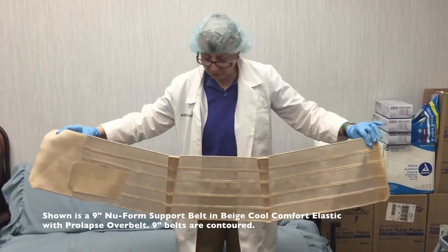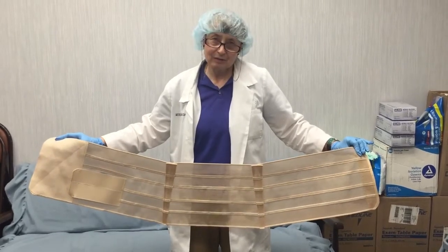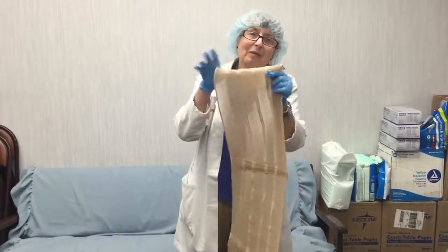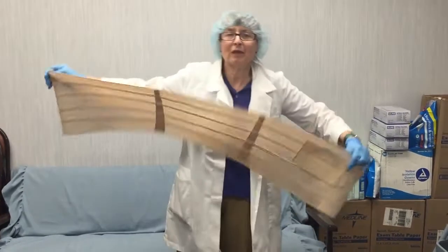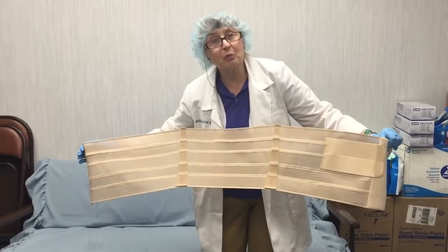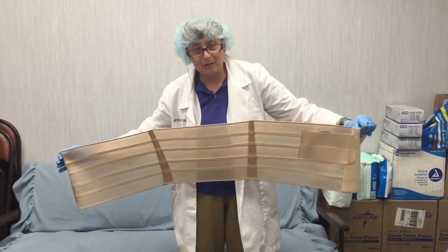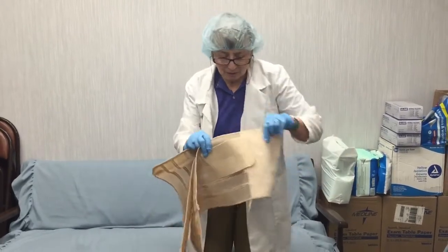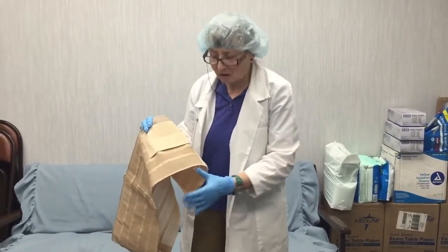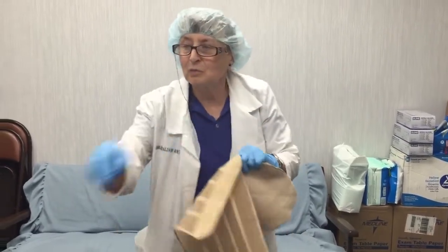Nine-inch belts are typically contoured so that they are wider at the bottom and narrower at the top — most women are a little wider at the bottom and narrower in the waist. However, with a man, it may be better to reverse that so it's wider at the top and narrower at the bottom, which is what I've done for this particular gentleman. When we had the belt on, you could see how it was going to dig and cut at the groin, so we're going to modify the belt so that it won't be doing that.